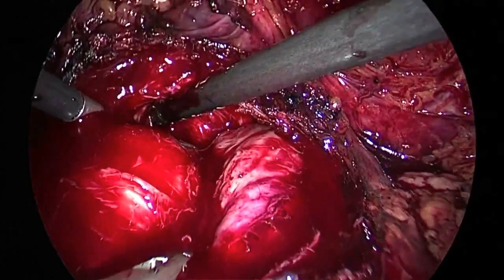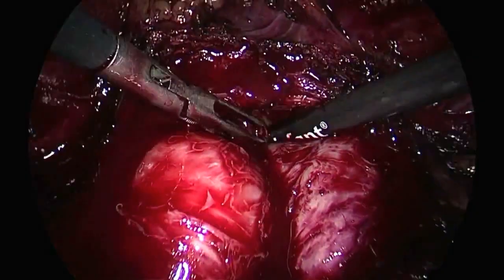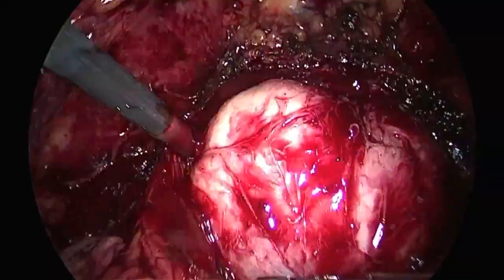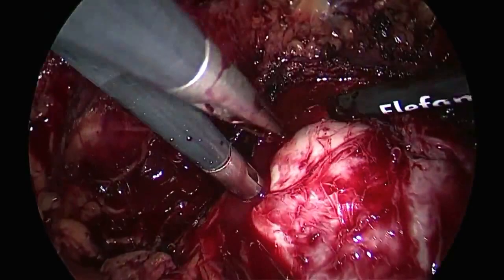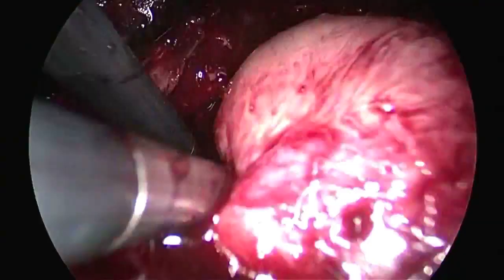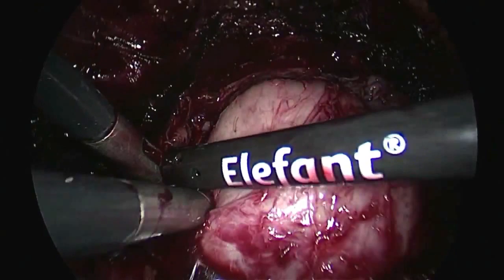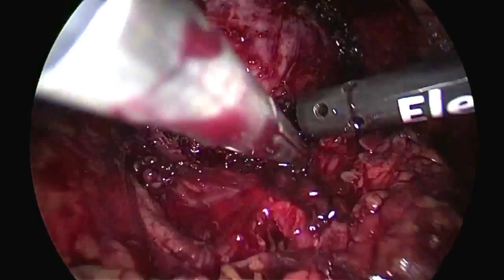Okay, it's clear, there is the urethra at the end. In the right side. Look at here, here, and so I am dissecting step by step the adenoma, back, back.